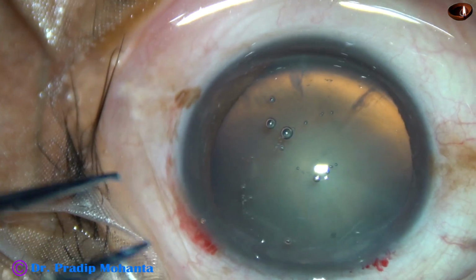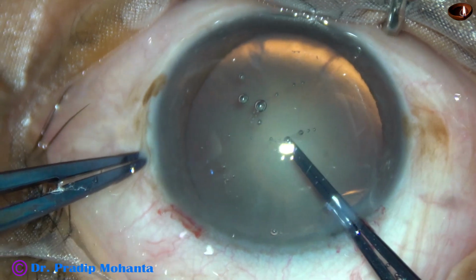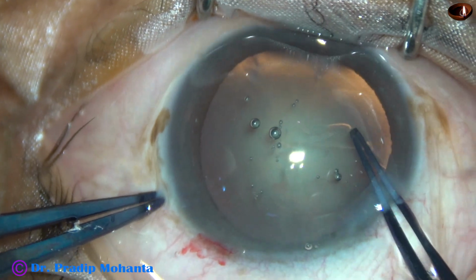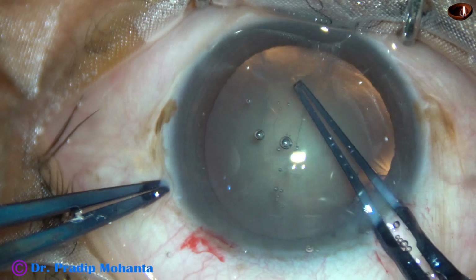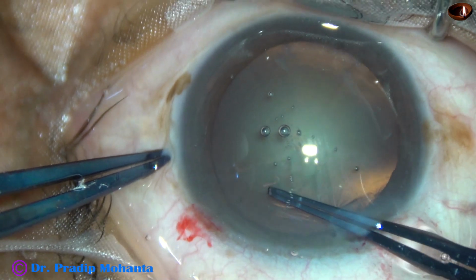Now let us observe capsulorhexis. The anterior capsule is pierced by the tip of the utrata forceps. A capsular tag is raised and the tag is guided anticlockwise to do an adequate sized continuous curvilinear capsulorhexis.